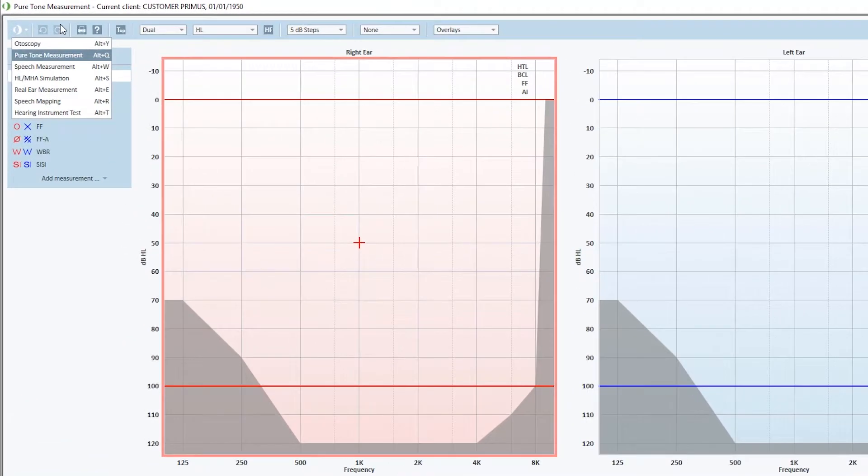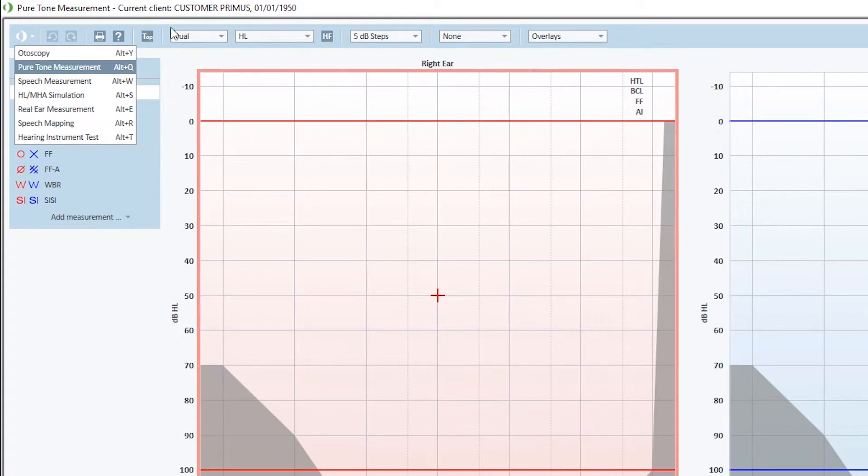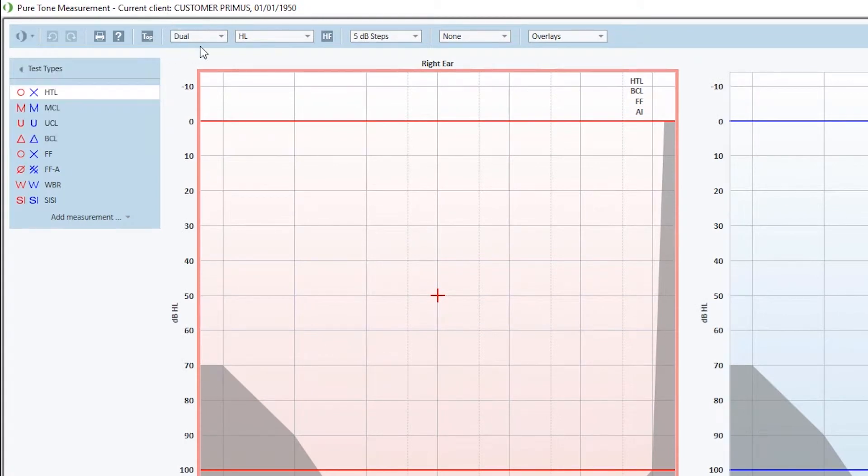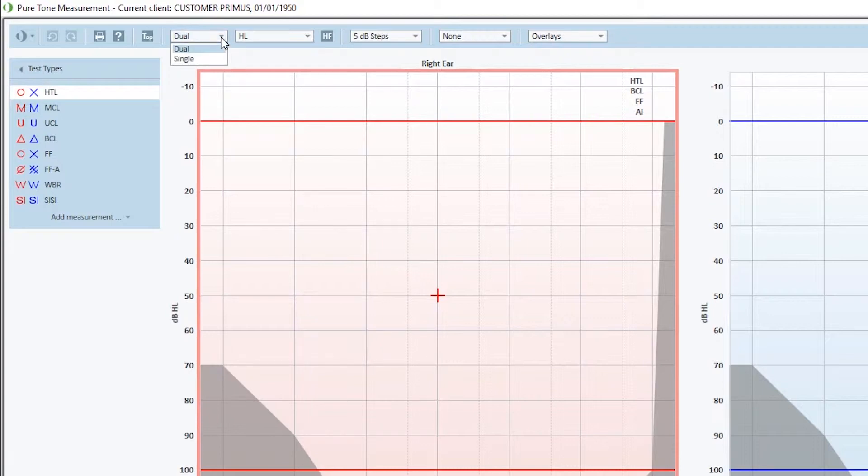At the Toolbar, you'll find quick navigation between the modules. You'll have the option of printing and the option of setting the display of the audiogram to be single or dual view.